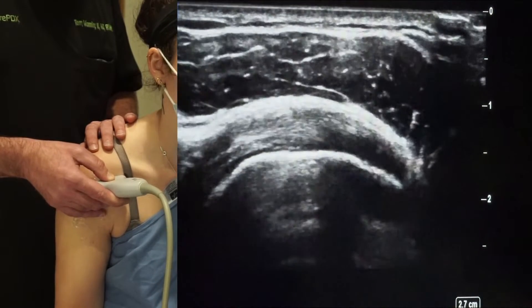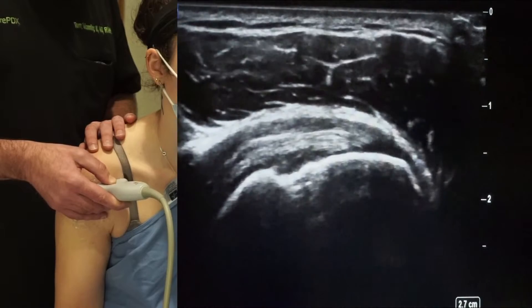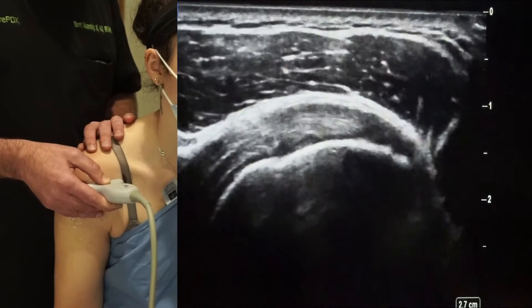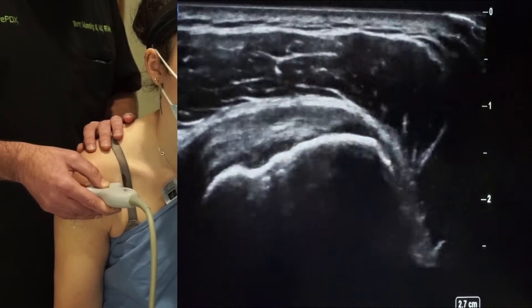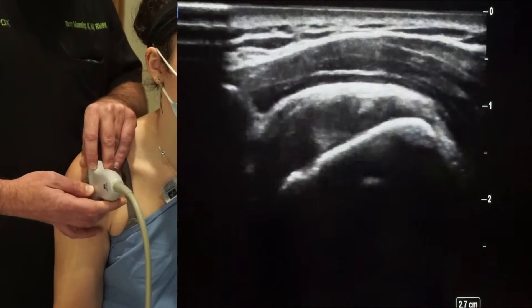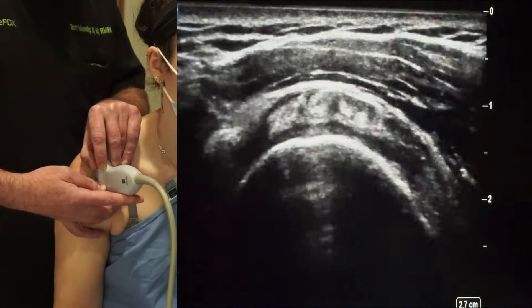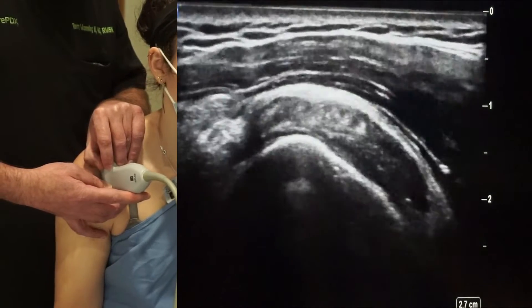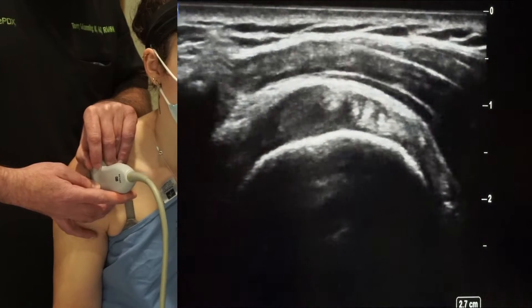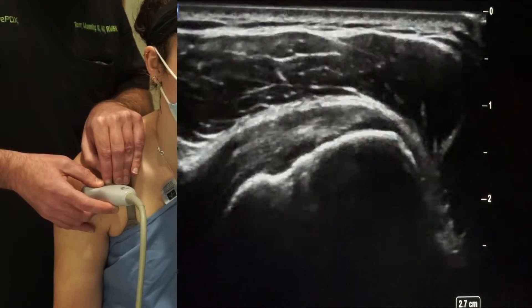As we are scanning, we're rebuilding our planes. The most superficial layer is the skin, then the deltoid muscle, then the subdeltoid bursa, and then the hyperechoic linear collagen bands of the subscapularis tendon inserting on the humeral head. That's what a nice normal subscapularis tendon looks like. We then rotate the probe 90 degrees to look at the subscapularis in short axis, where you'll see multiple slips of that tendon — that's normal. Those hyperechoic structures are the normal tendon; there are usually three or four of them and those are not calcium deposits, despite what some colleagues might think.